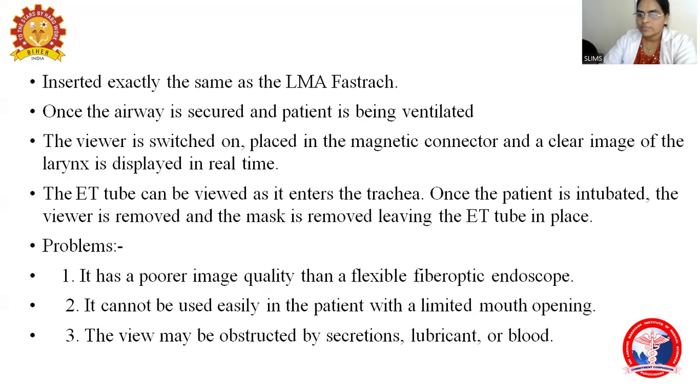The problems: it has poorer image quality than a flexible fiber optic endoscope. It cannot be used easily in a patient with very limited mouth opening. The view may be obstructed by secretions, lubricants, or sometimes blood.